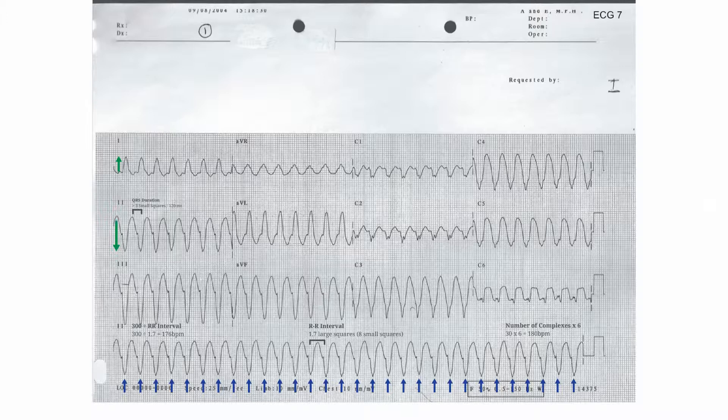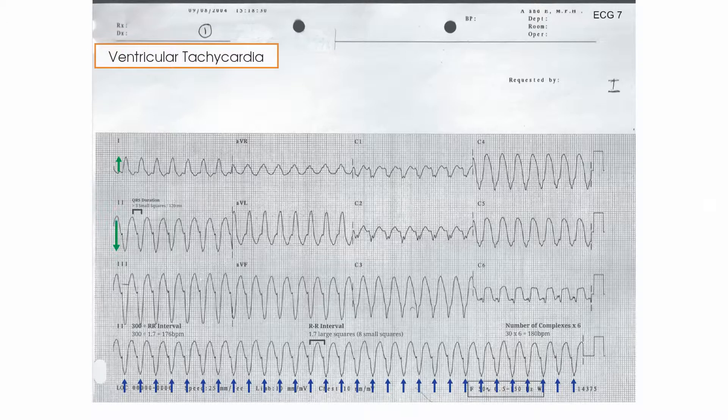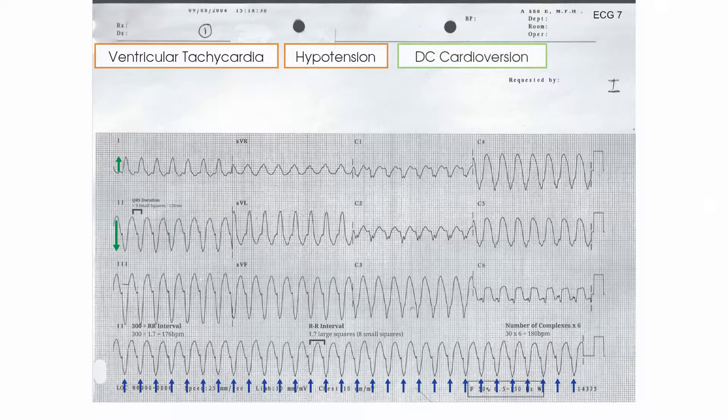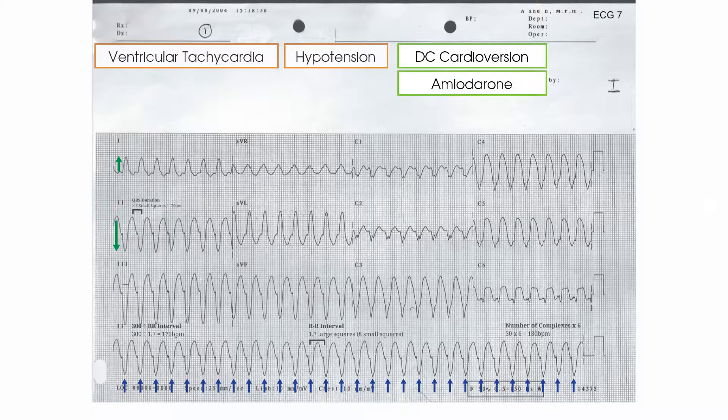In summary, this is a broad complex tachycardia which should be thought to be ventricular tachycardia until proven otherwise. Ventricular tachycardia is a medical emergency and when accompanied by hypotension should be treated with DC cardioversion. It's possible that medical cardioversion could be achieved with drugs, for example amiodarone, whilst waiting for the equipment for DC cardioversion to be put in place.